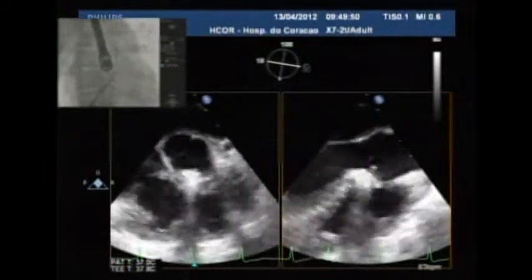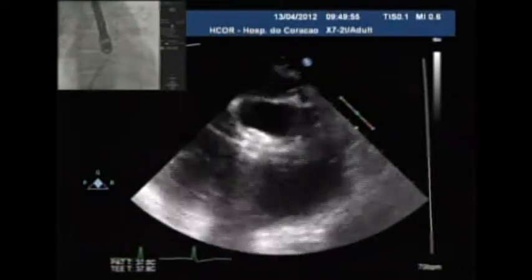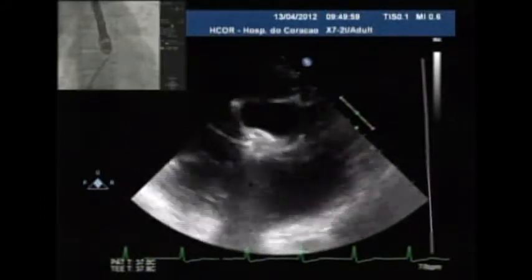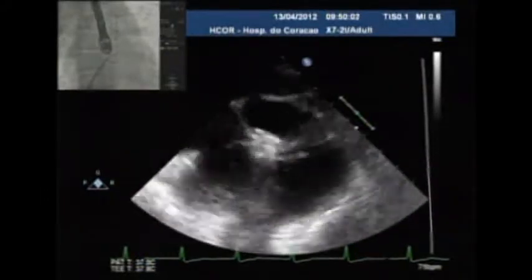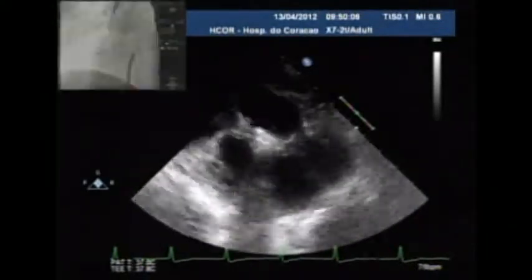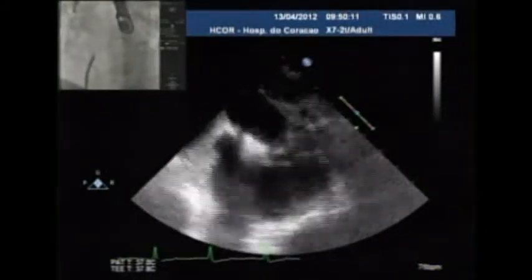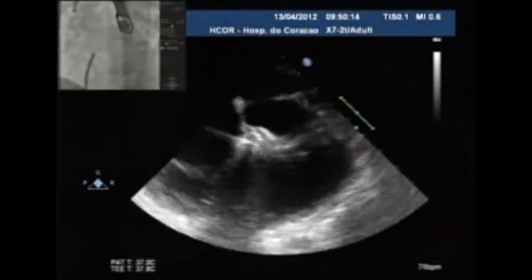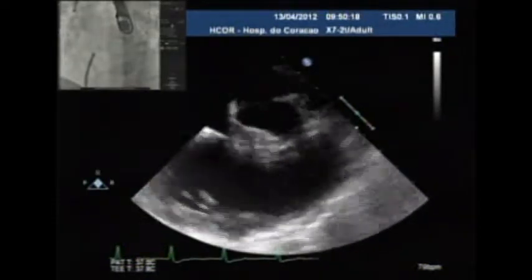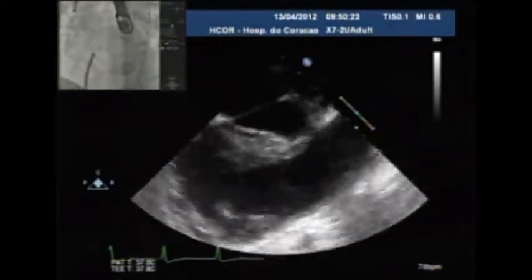Yeah, he's doing that. Just that aortic leaflet as well. So, yeah, there you go. Are you guided by echo or by angio, or both? No, in fact, we are doing fluoroscopy here. You can take some pictures with your pigtail catheter, but I don't want to give any contrast to this patient.